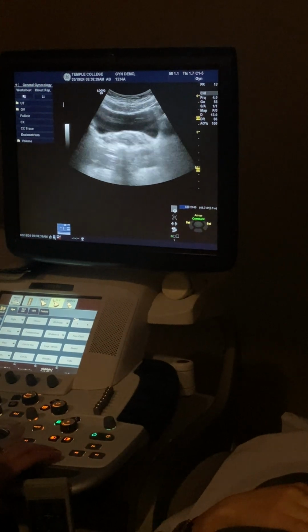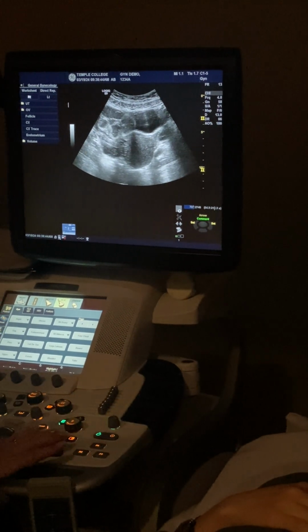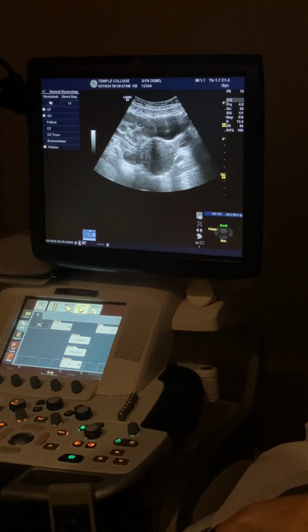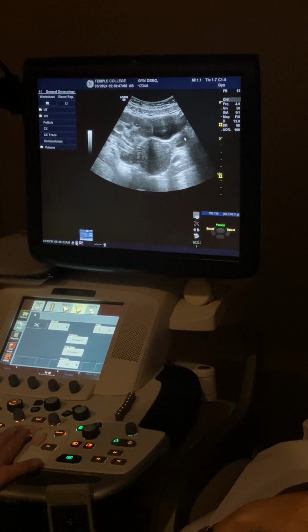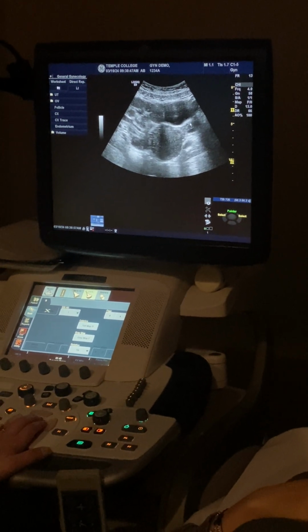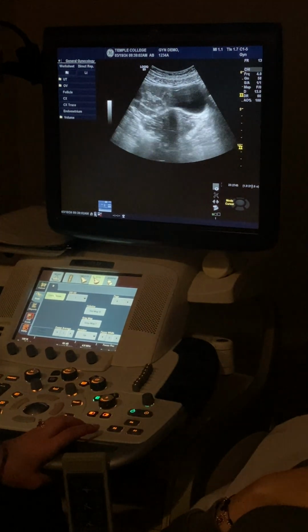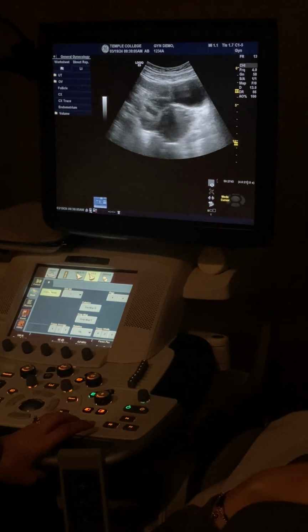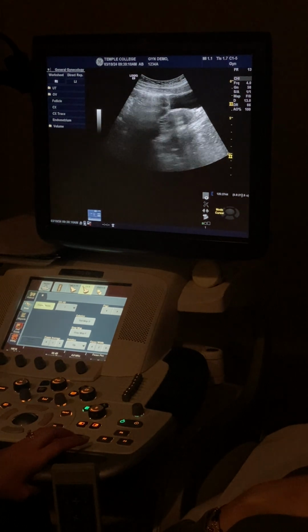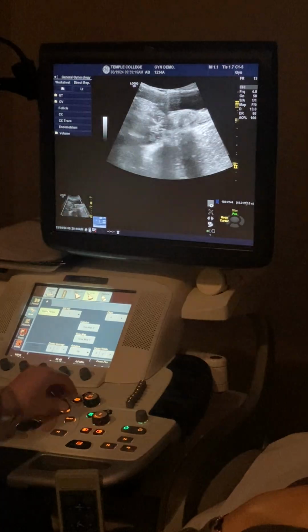So for her, the fundus is pointed down, so I'm going to start from the cervix and work my way up. You see anything interesting in this picture? Ovaries! Here and here. See how that comes off right there? That's a tube. So that's going to lead me to an ovary. This ovary looks like it's a little more snug with the uterus, but that's exactly how you're going to find them. And now I see, okay, well here's the right. I'm going to try and turn on it. No gas. Okay, so it's got a little bowel gas going on.